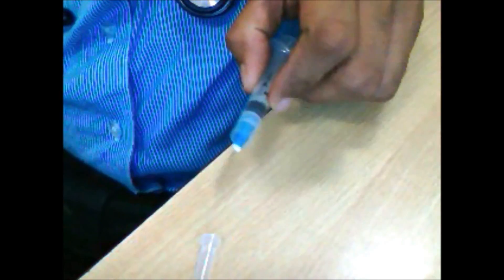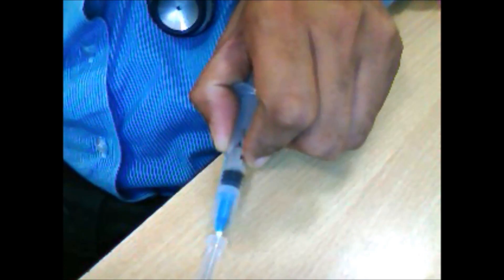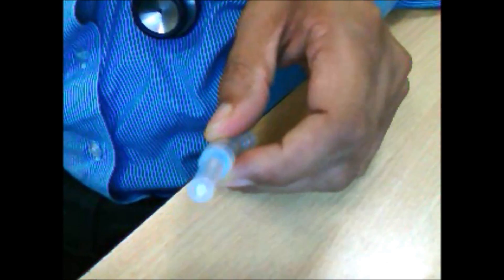You put the holder on the table like this, then insert the needle into it like this and hold it. After that, if you want to carry it towards the disposal, hold it in your hand like this. Do not hold it pointing forward because someone approaching from the front could get injured.